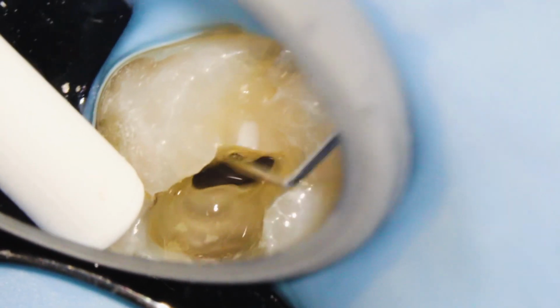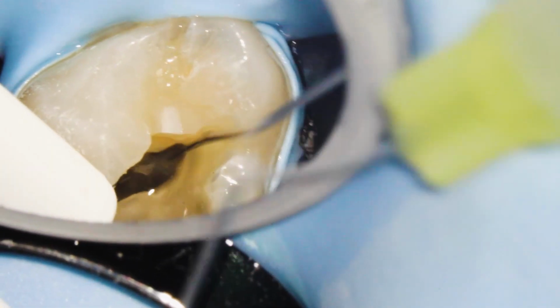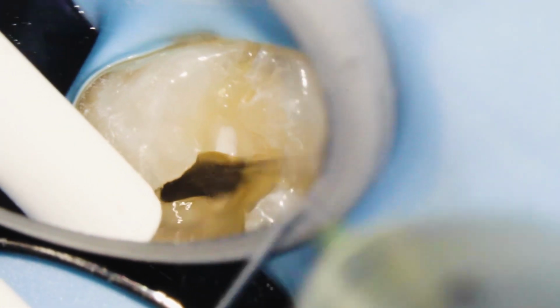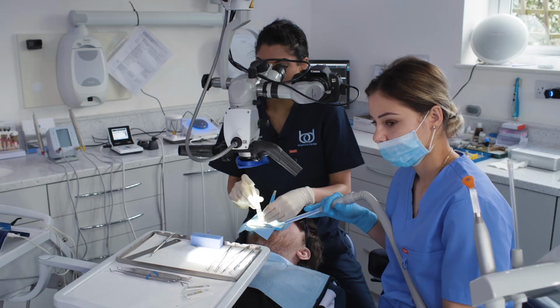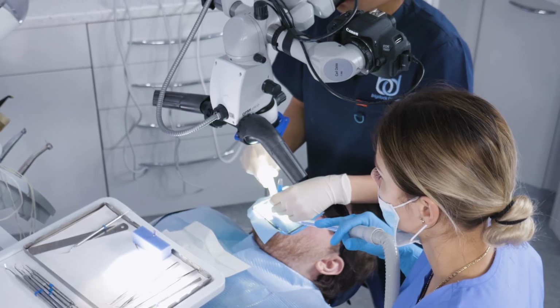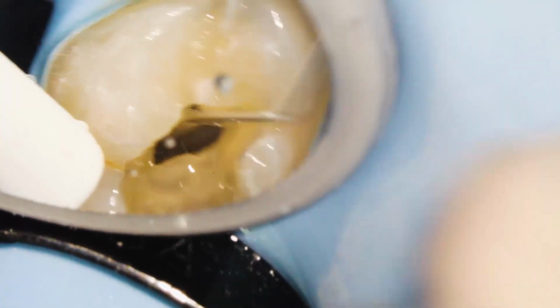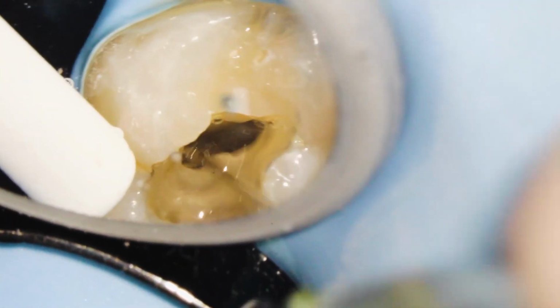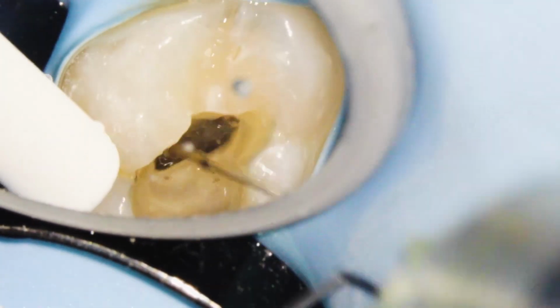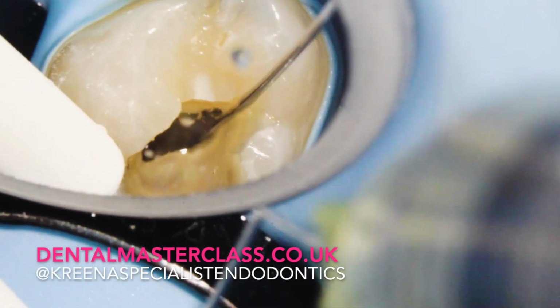So about 5% of people have a flare-up after root canal treatment. But we can try and minimise that by really disinfecting coronally prior to taking files further in, because otherwise we get this hydraulic effect where bacteria is being pushed down the canal and potentially through the apex. You'll notice during my treatment I use a lot of sodium hypochlorite, so this is almost a full syringe that I put into the pulp chamber before I even take anything down there.